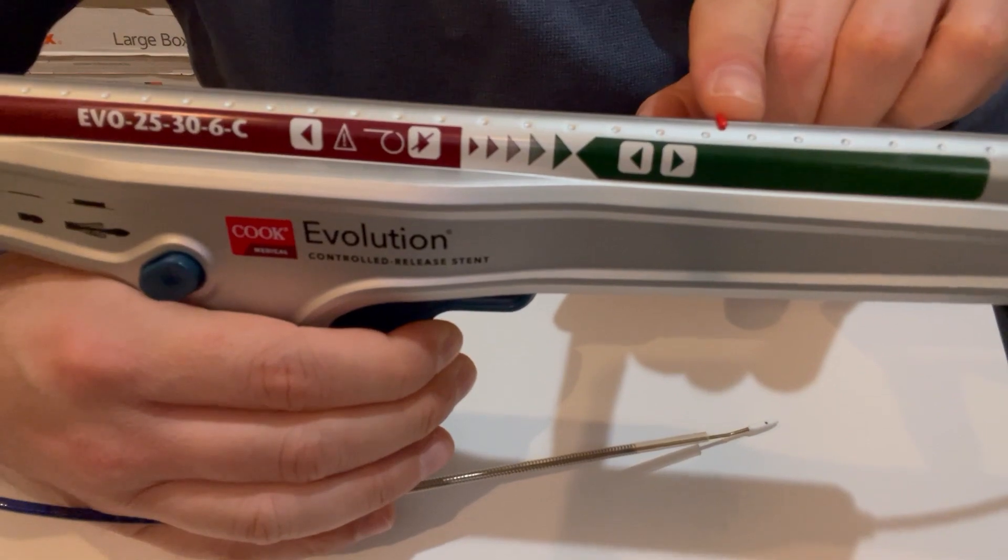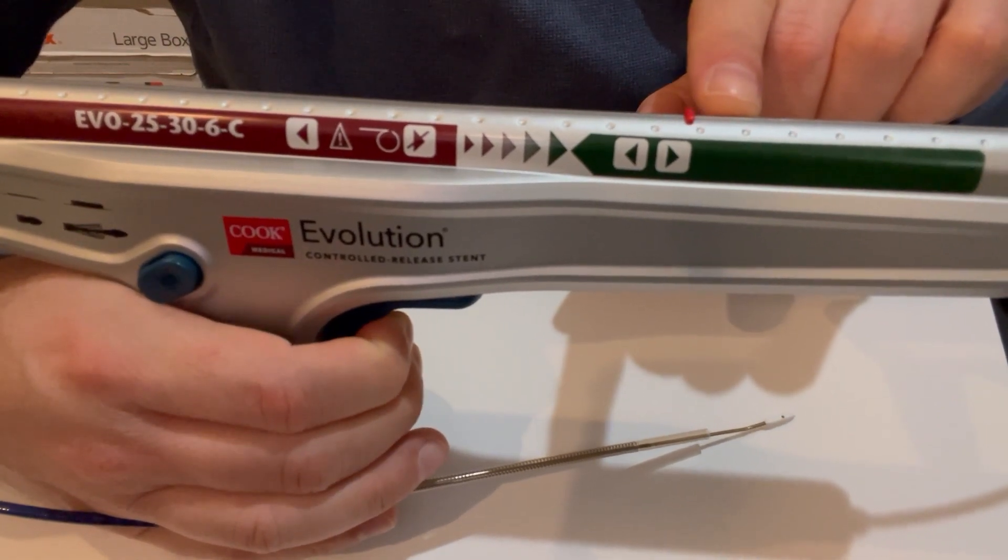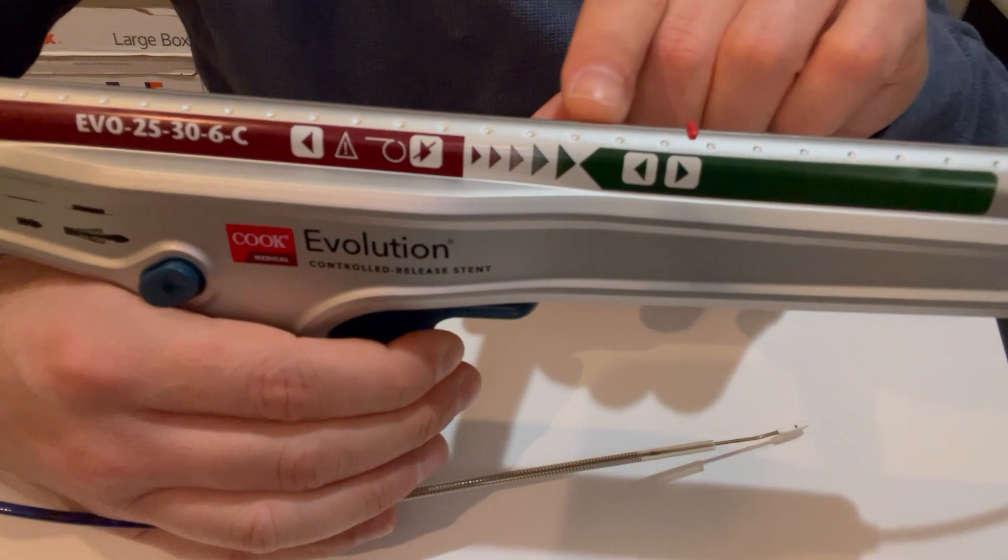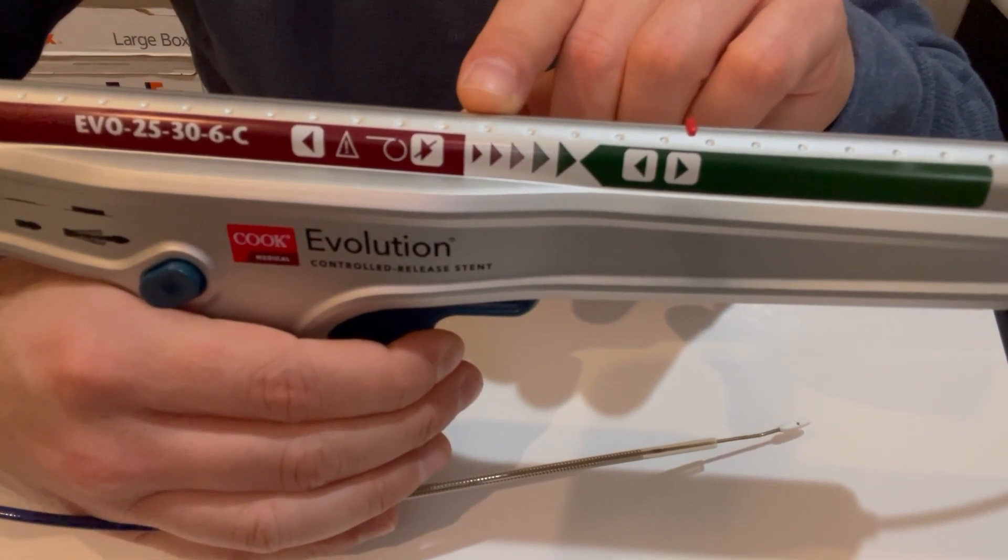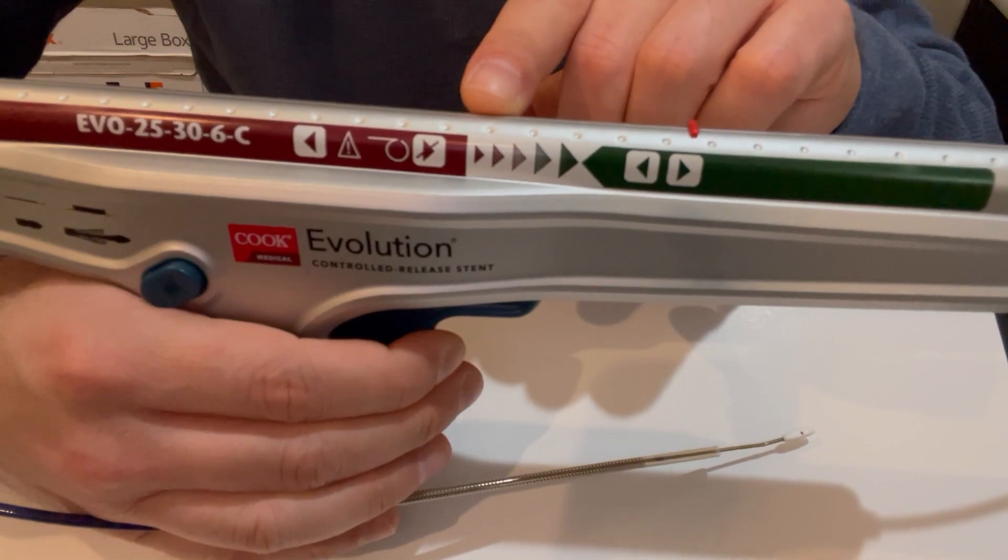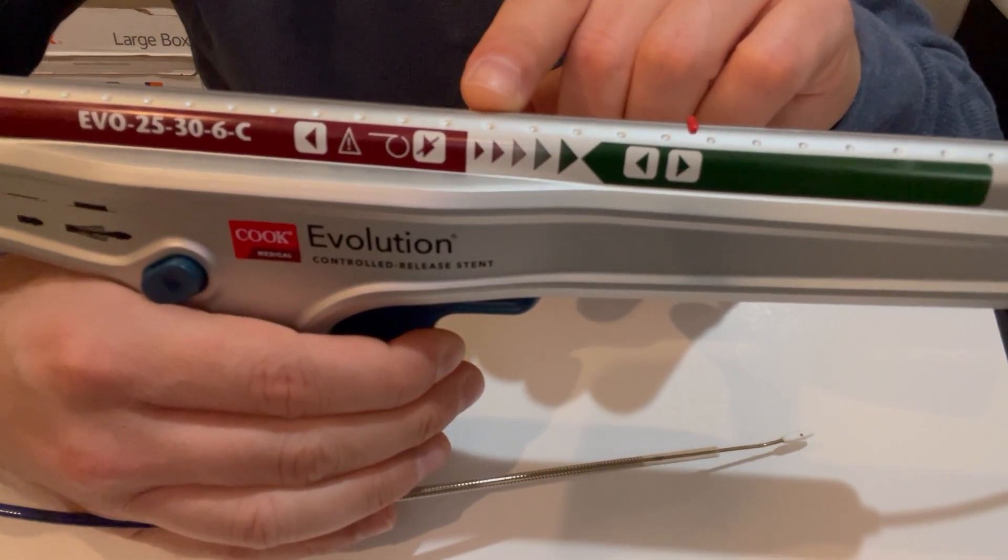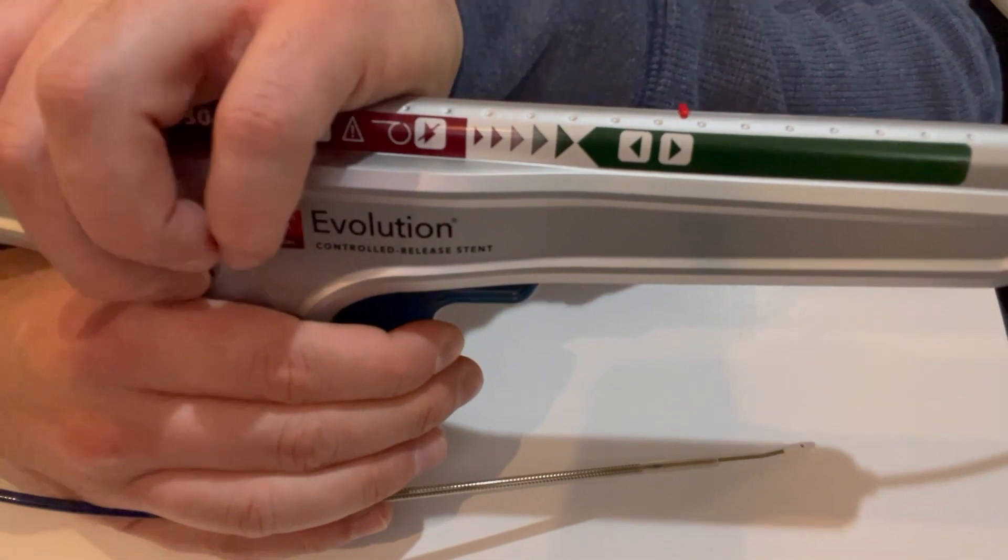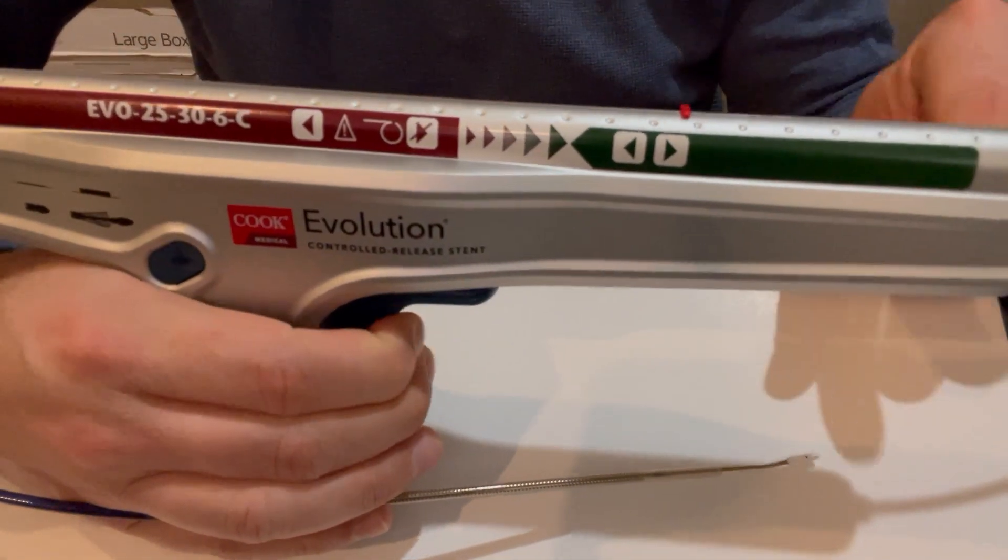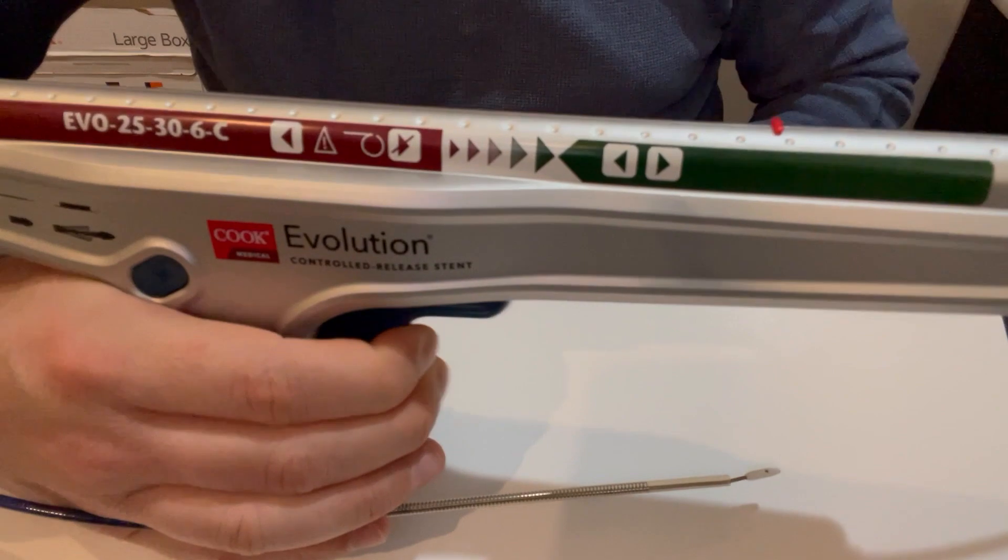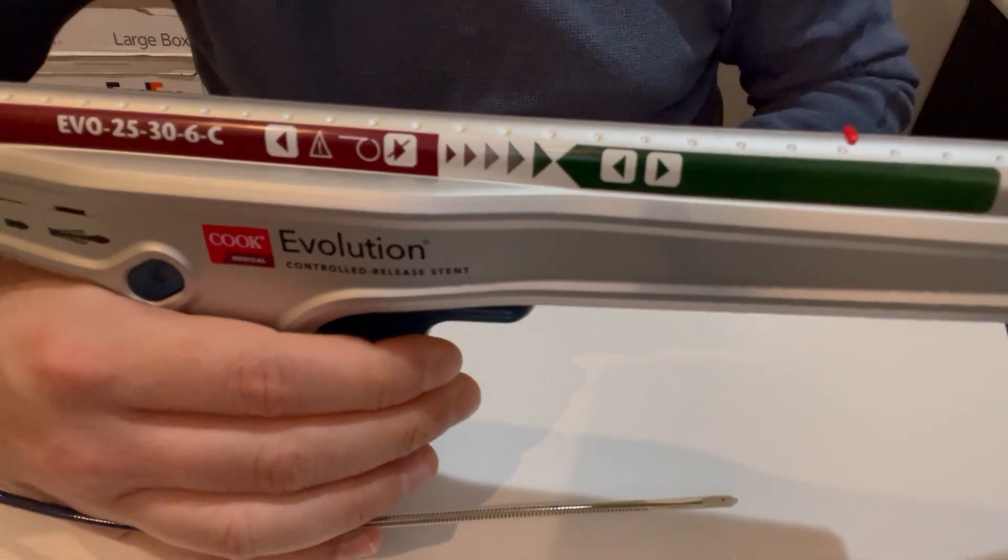As you see, there's a red marker that moves along and gets to a point where it shows you the point of no return. You can recapture the stent if you're not happy with your stacking. All you have to do is push this button and you reverse the capture of the stent.